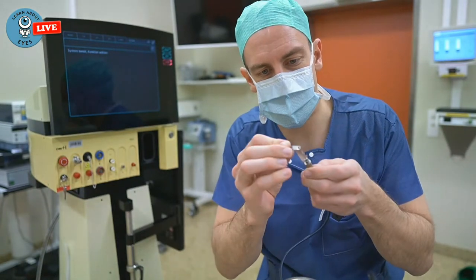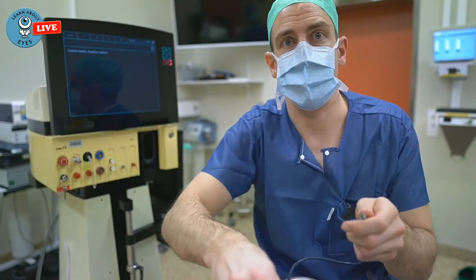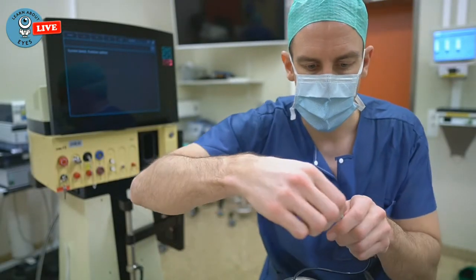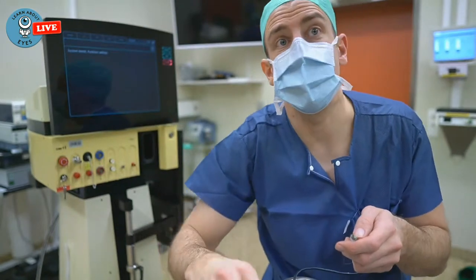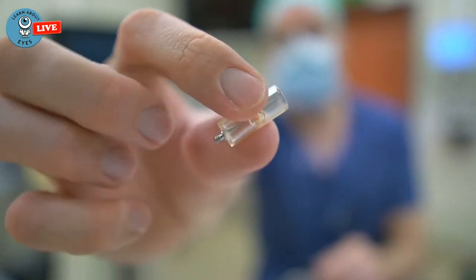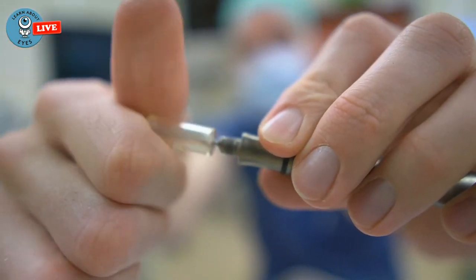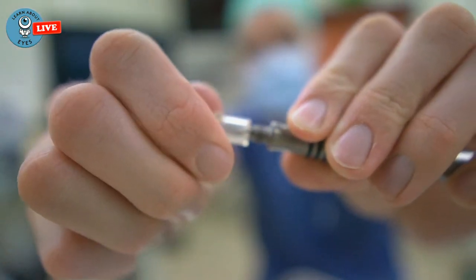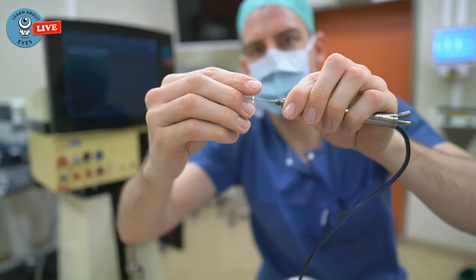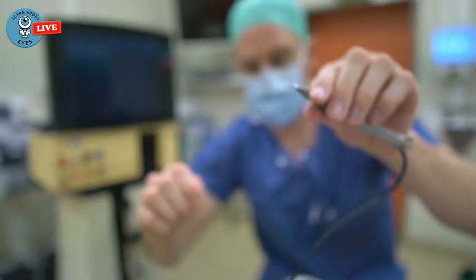All right, so this is how you take off the old phaco tip. There is a little instrument that is delivered with it. Maybe you can see it here. And then you take the old one off. Usually you're throwing them away after the operation. And then for the new one, you get this preloaded already and you put the phaco tip in here. Okay. Pull it off. Maybe retighten it just a bit more. Pull it off and then it should be good, like that.